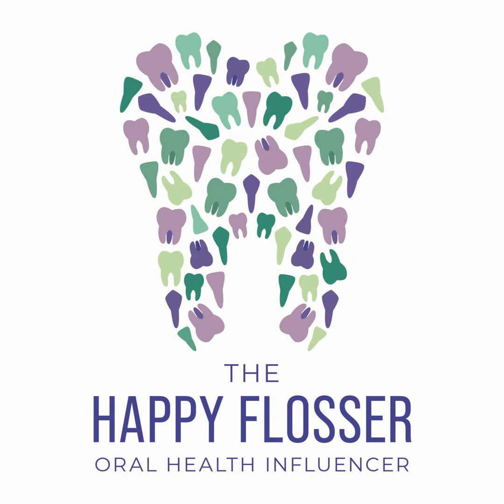And then I'm going to be looking at my bite wing radiographs to evaluate for caries. I'm going to be looking for those radiolucent notches in the enamel, maybe some triangulation, triangular radiolucencies that maybe have gone through the enamel into the dentin. I might be looking to rule out cervical burnout. I might be looking for recurrent decay underneath some of those restorations, any suspicious lesions. So sometimes there might be something that's an early, right? We know that early things are harder to detect.